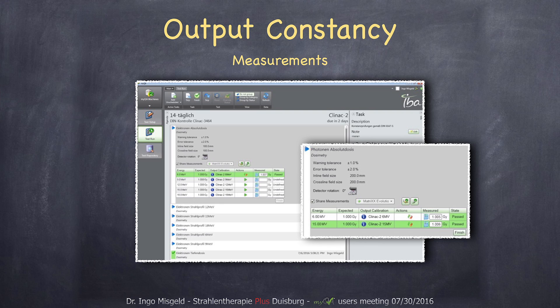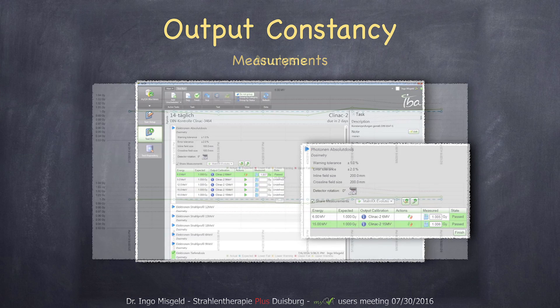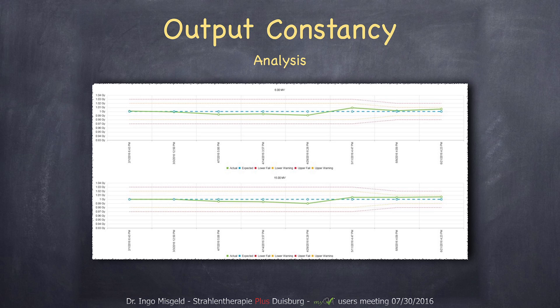After that you can analyze these measurements in the trend analysis. Over time you can see your outputs plotted, and you can see the limits you can set: the warning limit and the fail limit. You can also see that we changed these limits at some point to be a bit stricter. This is all kept in the database, so you can still see when you changed something, even after a long time.